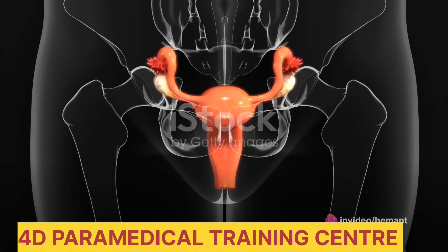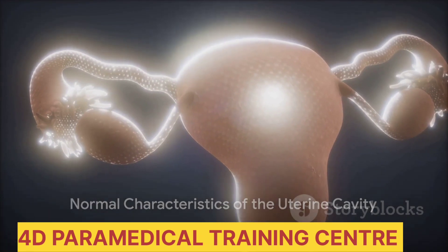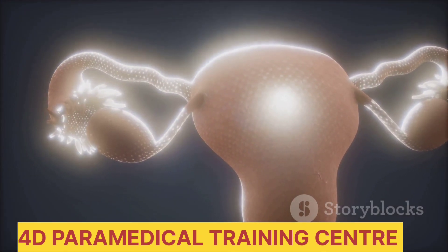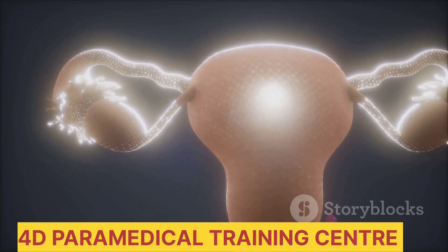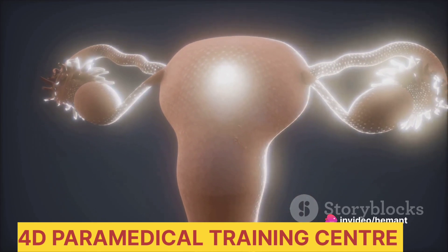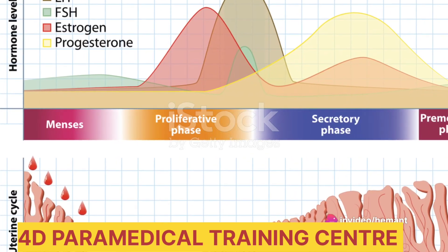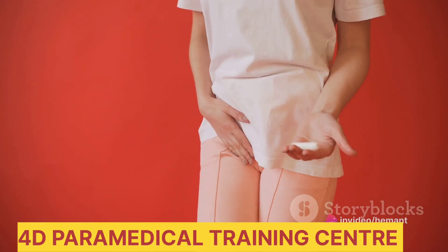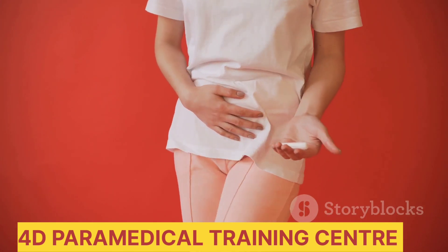The uterine cavity is typically normal in size and shape. What does normal entail? It suggests a pear-shaped structure with a smooth inner lining, also known as the endometrium. This lining is crucial as it thickens and sheds during menstrual cycles and provides a nourishing environment for a fertilized egg.